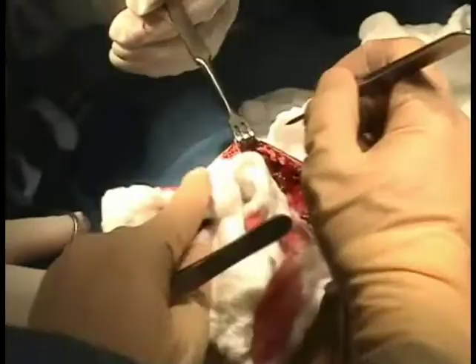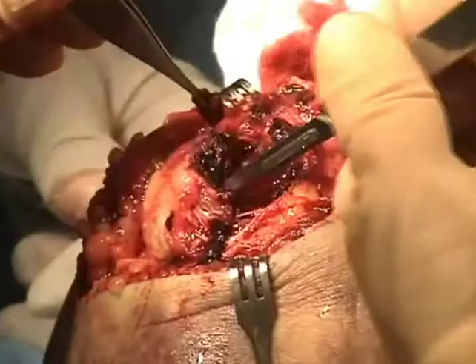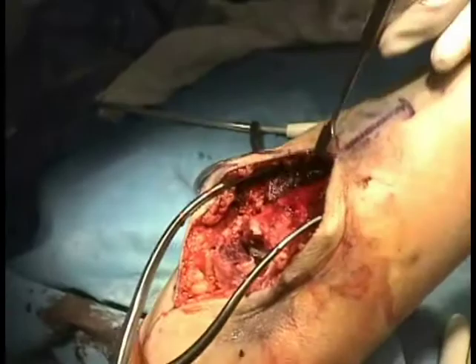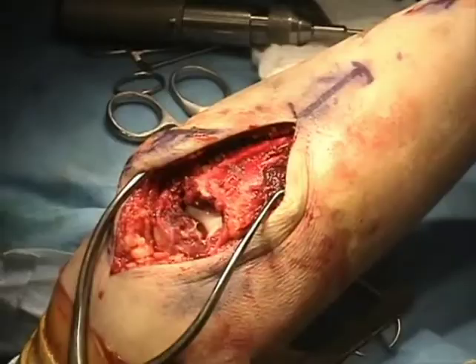One can see the hematoma present at the fracture site and the obvious displacement of the proximal segment. This patient was operated on about one week after the injury, and it is important to save the fracture callus which has already begun to form and consolidate, which can later be replaced and assist in bony union.